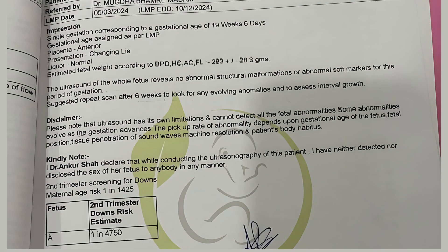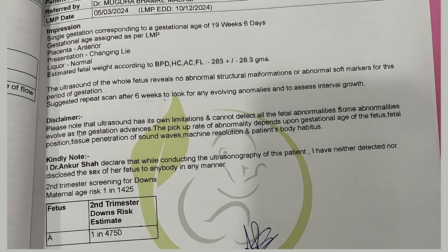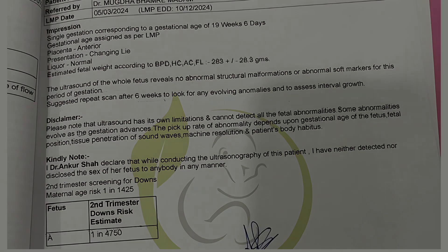The diagnosis of angular pregnancy was ascertained. After this, the procedure was stopped and the pregnancy was allowed to continue. This pregnancy progressed well with a normal anomaly scan report, and we successfully prevented the unnecessary excision of the pregnancy.